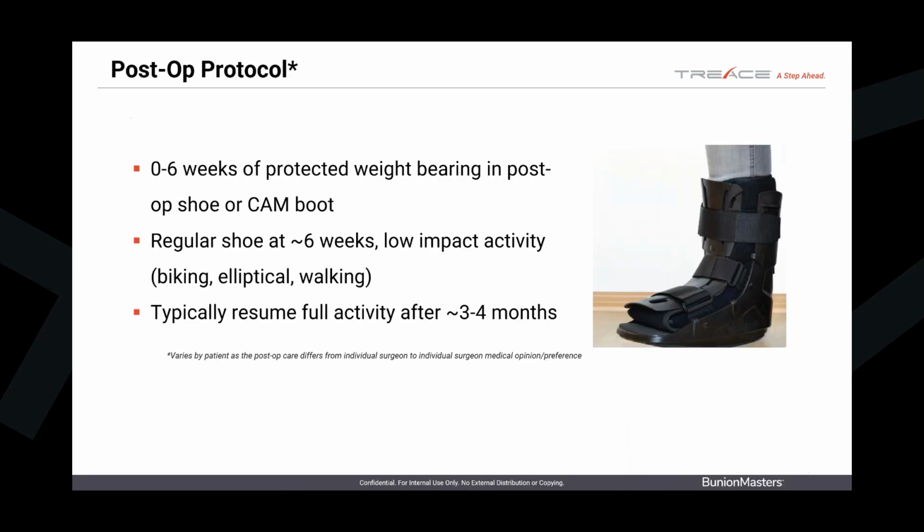So what is your post-op protocol? Well, my post-op protocol is a little different than others, but you can follow whatever you want. I start weight bearing in a surgical shoe immediately after surgery. I ask them to weight bear on the heel for the first 24 hours while they're numb, and then I advance them to full flat weight bearing. I will move them out of the surgical shoe at week 5, and I'll start them with a tennis shoe.